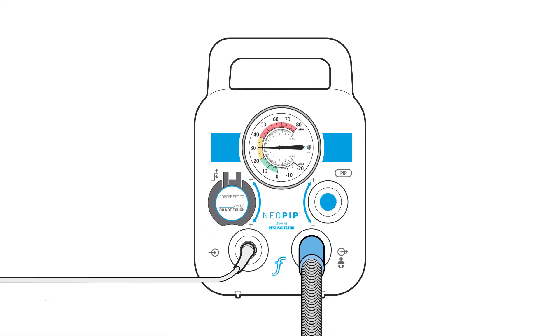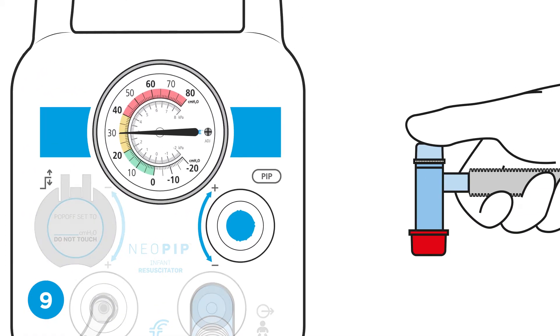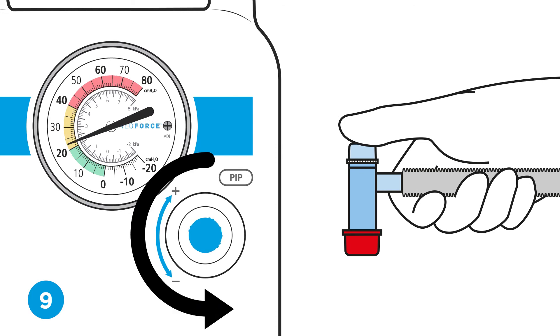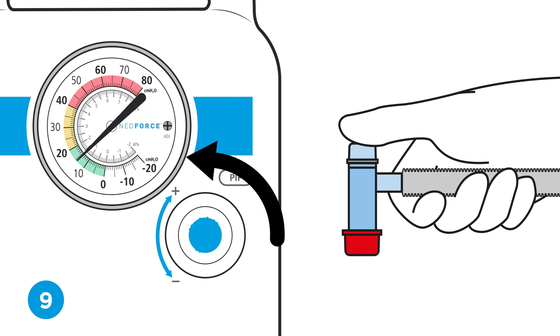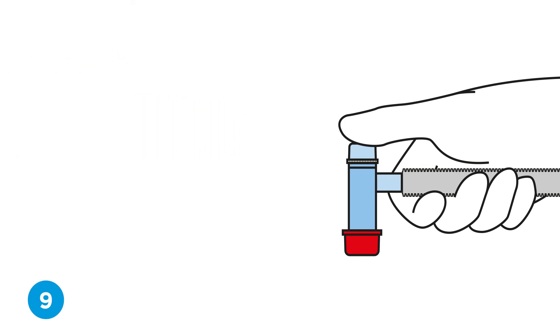Step nine, set the PIP. With the TP circuit occluded, turn the PIP control several turns counterclockwise to set the desired PIP.